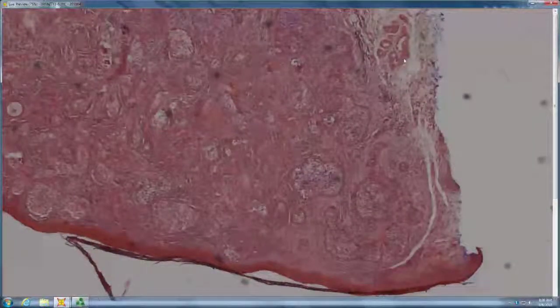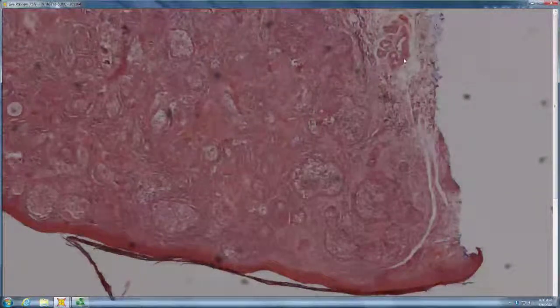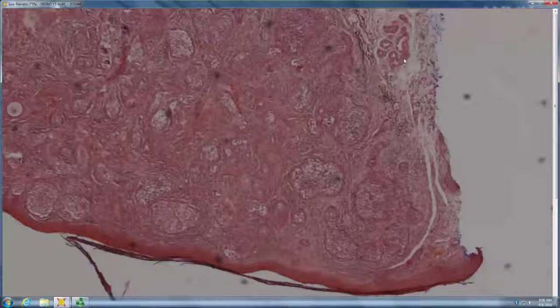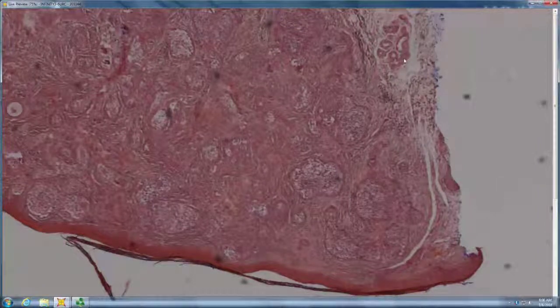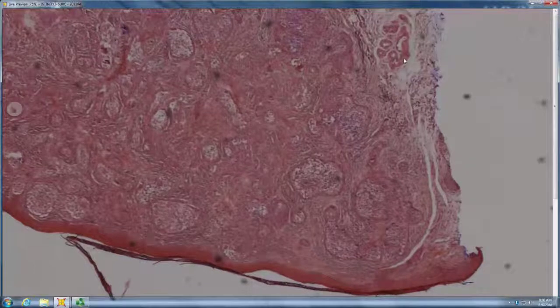Looks like lymphadenoma. Why is it a lymphadenoma? It's got the basaloid cells kind of palisading with lymphocytes and histiocytes in the middle. Yep, so it's got the peripheral one or two layers of basaloid cells, it's got the fibroblast-rich stroma, and it's got lymphs and histiocytes in the center, so it is a cutaneous lymphadenoma, or if you like the easy name, the adamantinoid trichoblastoma. Nobody likes that name.